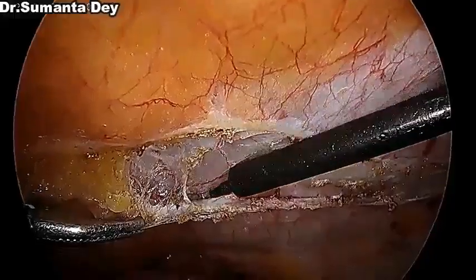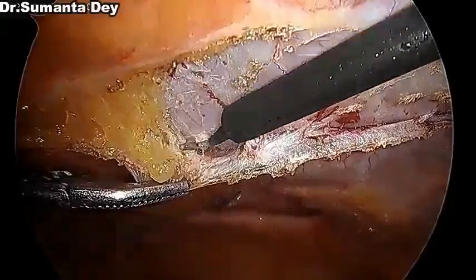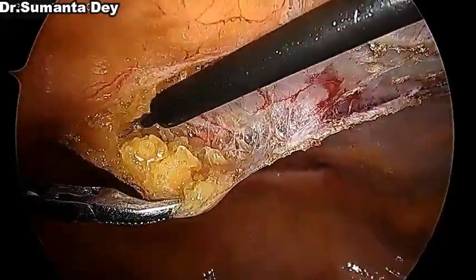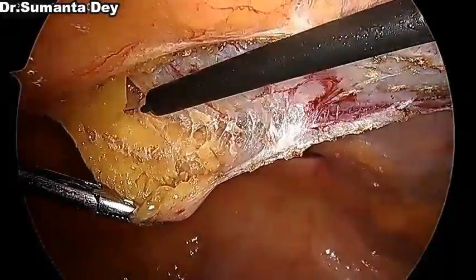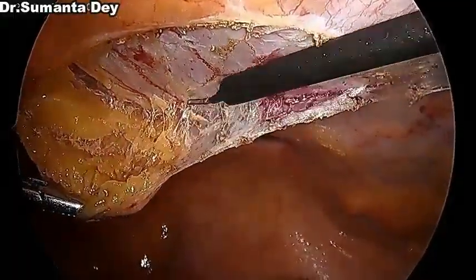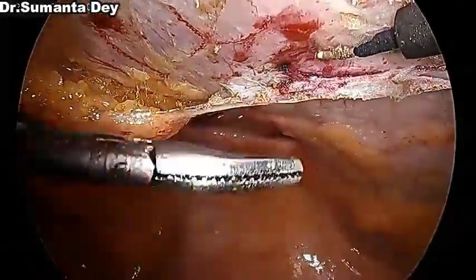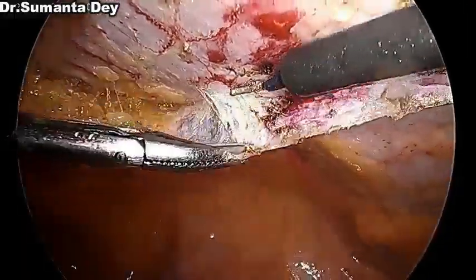Along with the peritoneum, you should take the peritoneal fat so that the flap becomes thicker, and give a good amount of traction with your left hand instrument. So gradually when you go down following the line, you will encounter the arcuate line. Once you are below the arcuate line, the posterior rectus sheath is deficient, and you have a good amount of fat in the peritoneal region, so your flap becomes thicker.